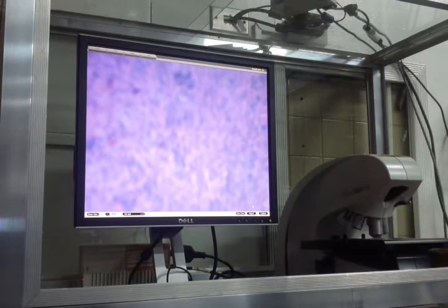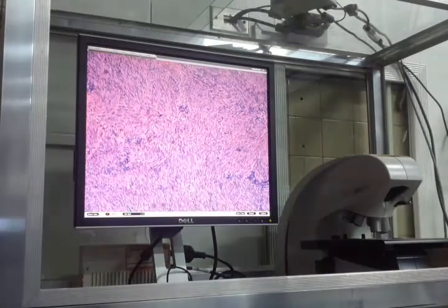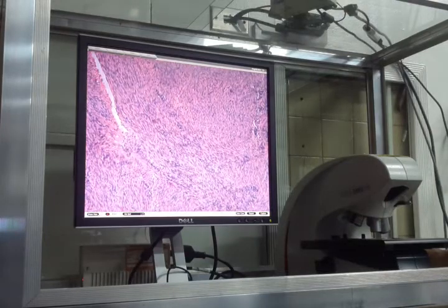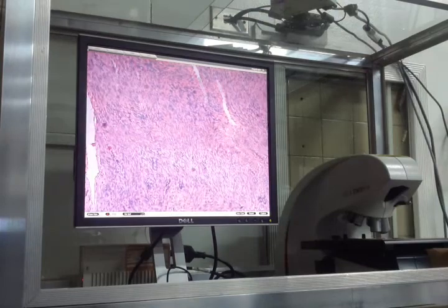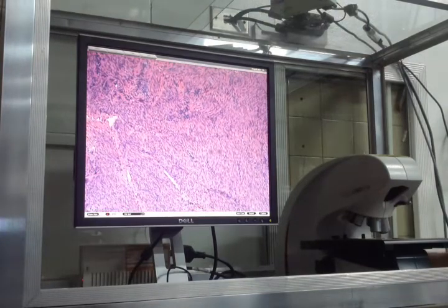Uniform color, uniform sizes. Kita kayong mitotic figure, uniform ba yan o hindi? Compare natin dun sa isa.